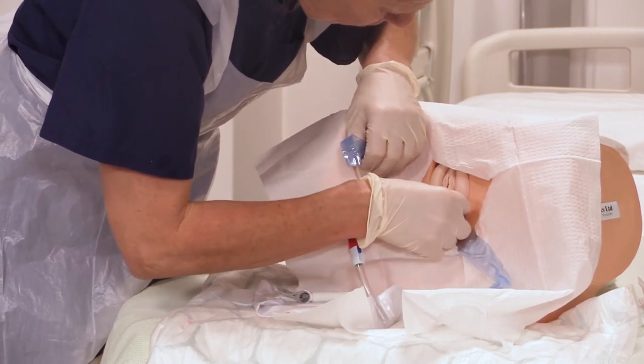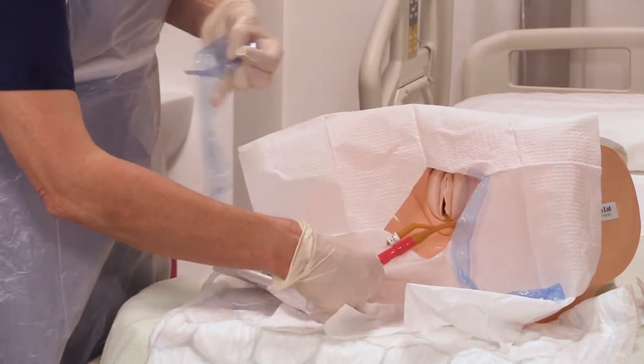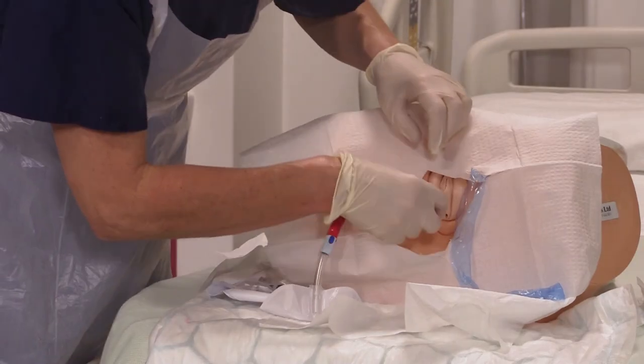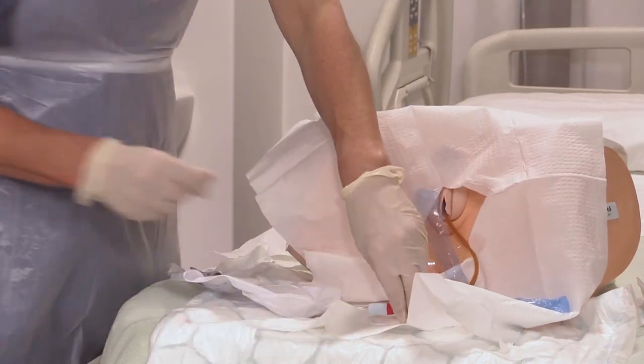Continue to insert the catheter and discard the wrapper. When urine starts to flow out the catheter, insert the catheter by a few more centimetres. The purpose of waiting for urine to drain is to ensure that the catheter is in the bladder and not in the vagina or the bladder neck before inflating the balloon.